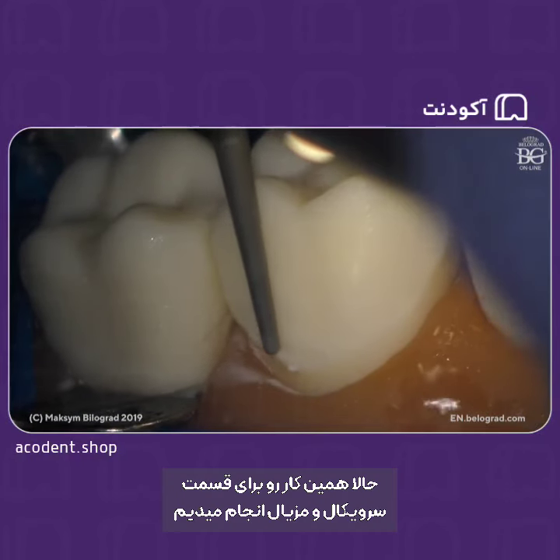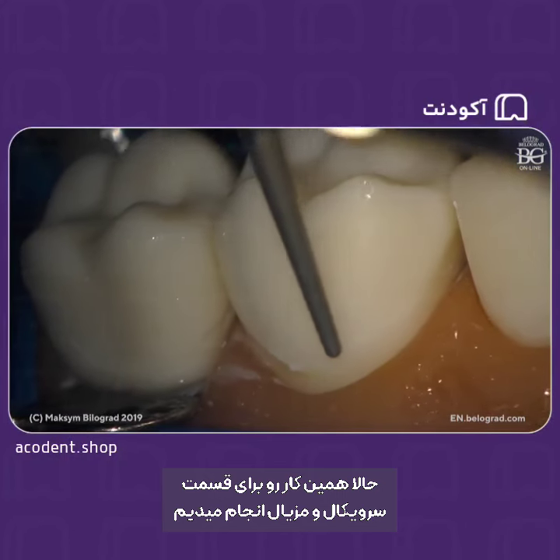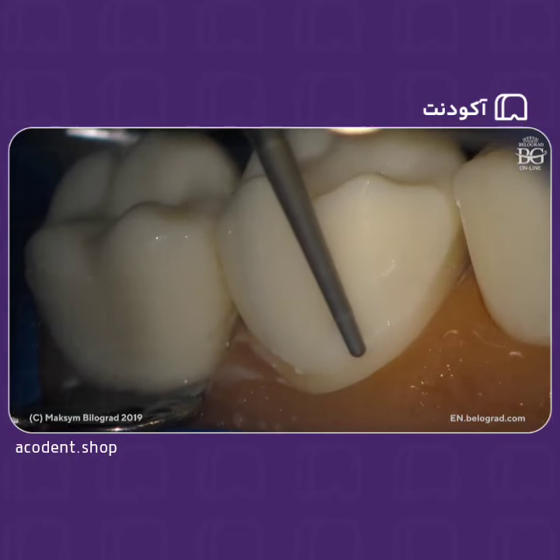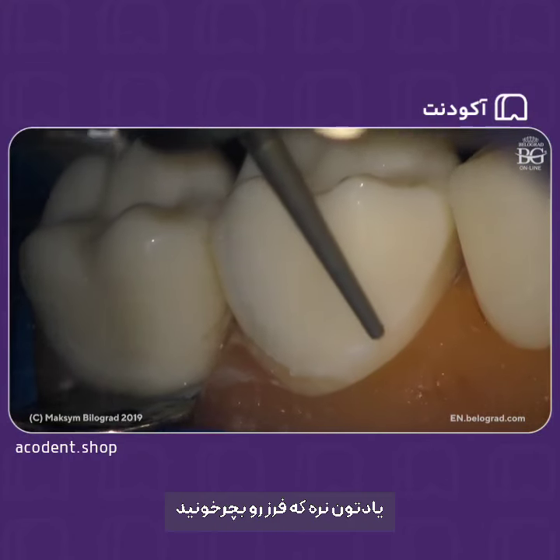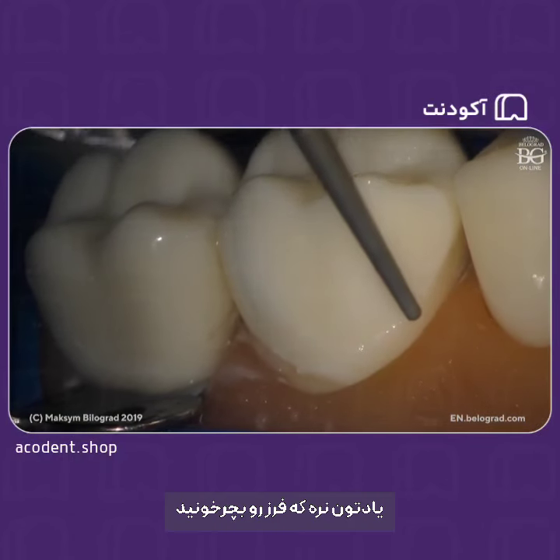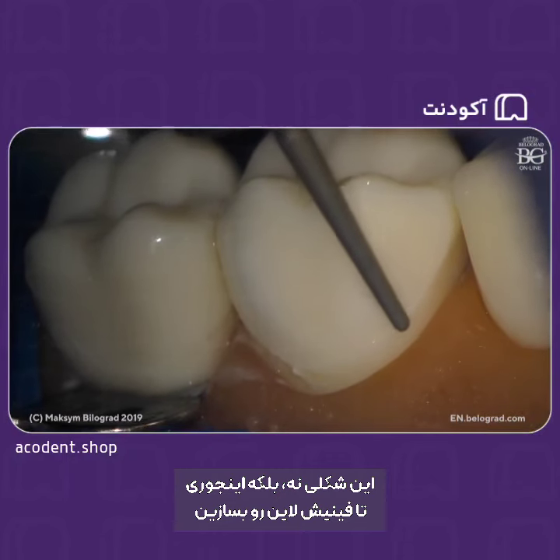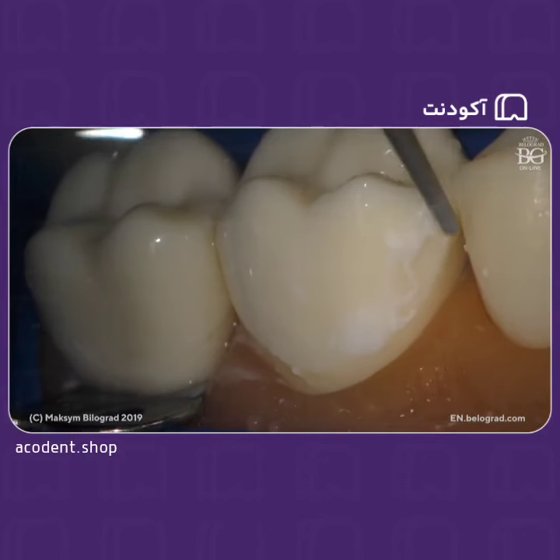So we'll do the same from cervical and meso. Turn, don't forget to turn, not this way, this way, to get your finish line done.